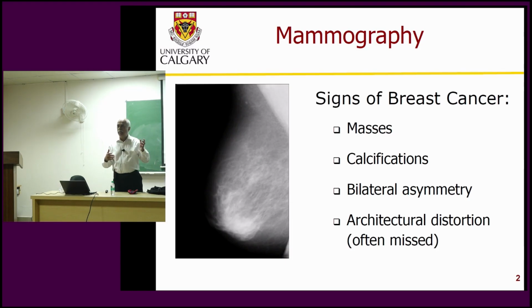It is screening. Most of them will be normal. Fewer than 10% will have some breast disease, and less than 1% will have breast cancer in a screening program. So for that 1% or 10% of the population, the rest of the population has to come and participate. But due to continued education and information being provided and improved quality, it has improved, certainly. And mammograms don't look like this anymore. This is an old film mammogram.